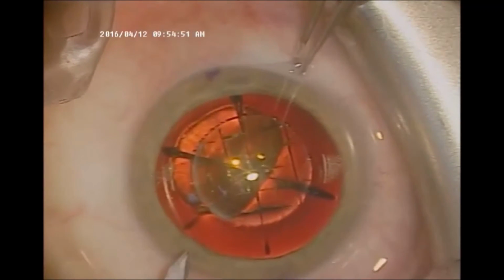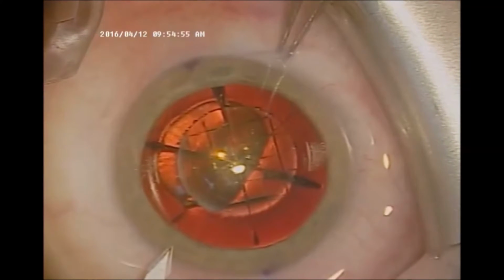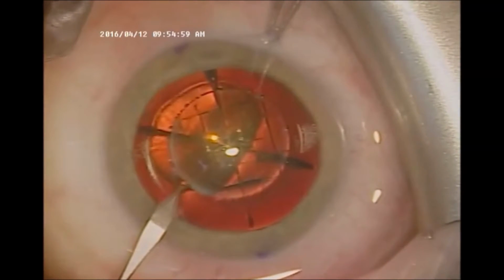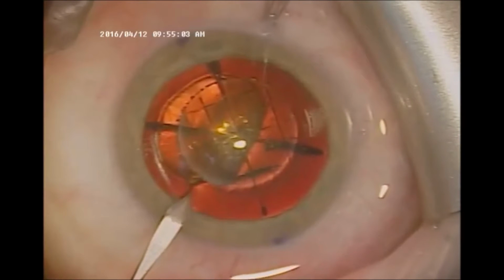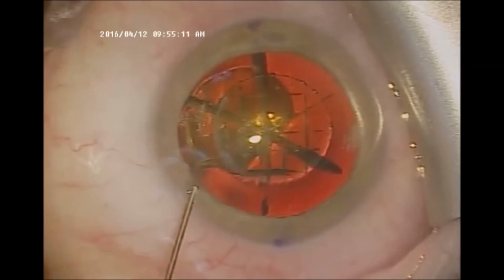So here I'm using a small blade in order to create a paracentesis or a side port, or in other words, a way for me to enter the eye. It must be wide enough for the cannula to enter the eye. This is approximately 1 millimeter in diameter.